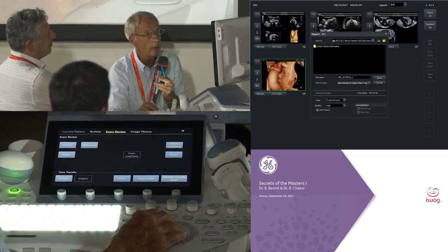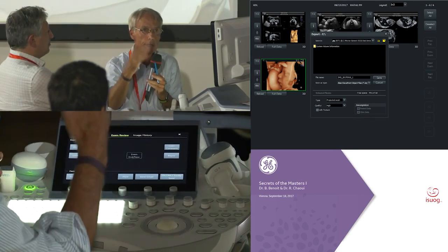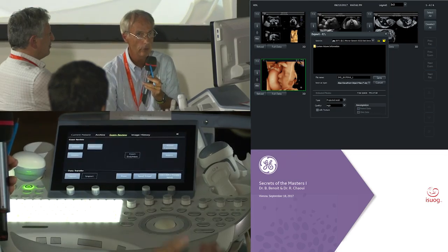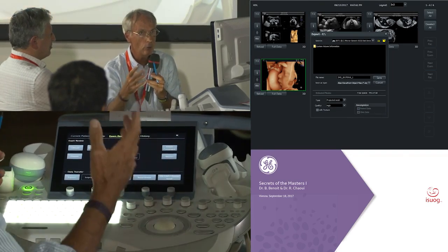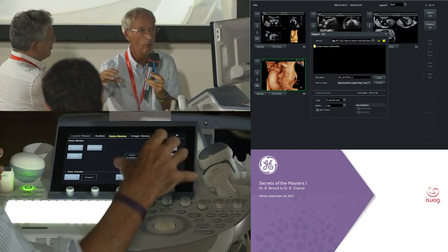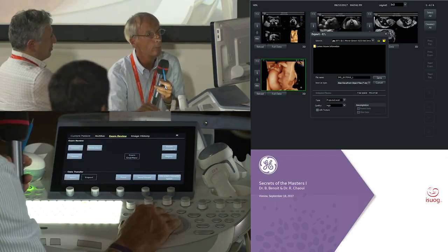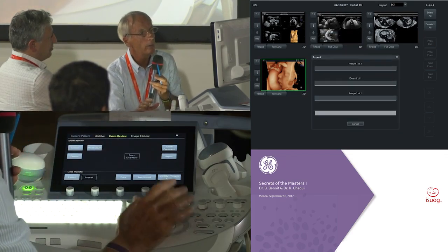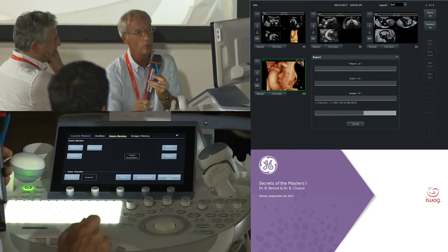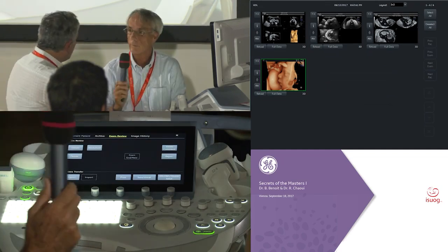That means with high quality, with texture, and you can open on any computer with 3D software, and after you can print it. So it's really easy. Before it was difficult to translate the volume into a printable format. Now it's easy. You just have to wait. It will take approximately 10 to 15 seconds to export, and it's okay. So you will tomorrow. Yes.